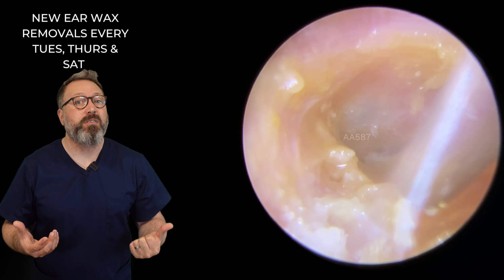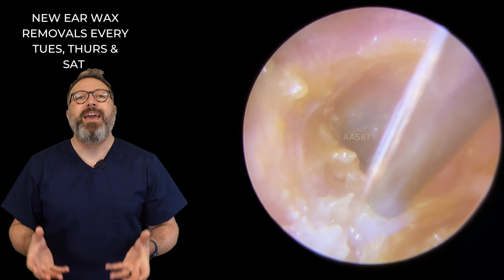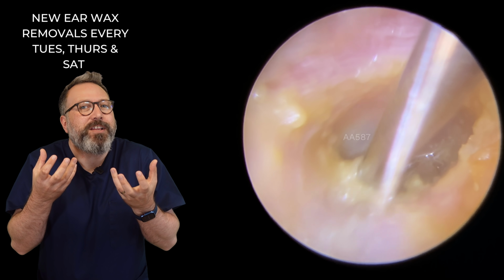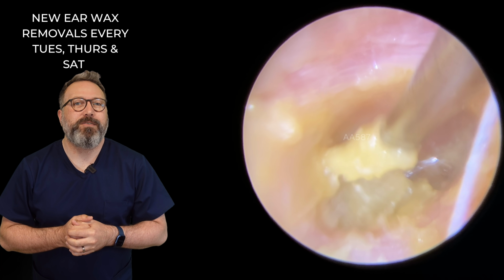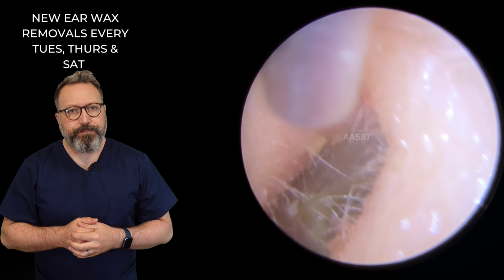Obviously you can't do that with your ear canals, but when you go in here with these tools and start removing that, it actually feels really nice. It's giving you that kind of deep scratchy sensation that you're not able to get by putting anything in there really. So you can see lots and lots of bits of dead skin coming away.